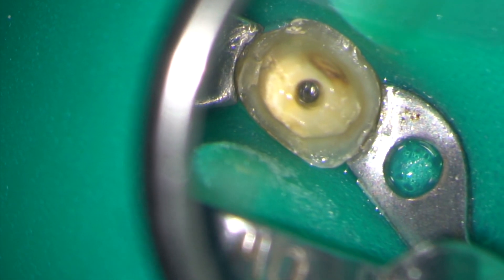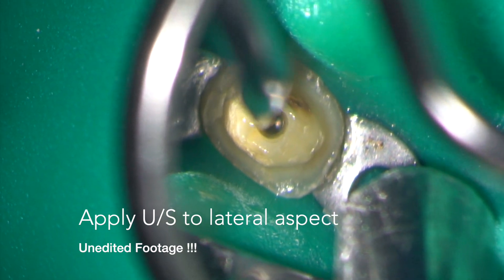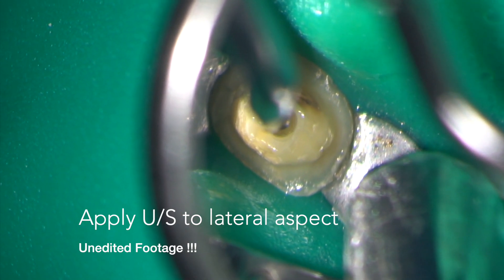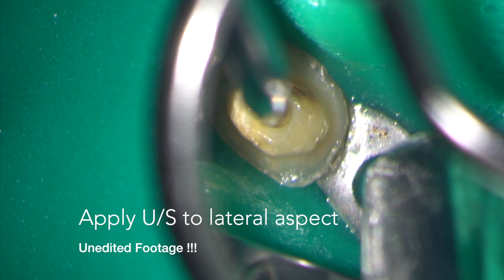The instrument is used dry, however it's sometimes helpful to have a little bit of liquid at the base of the access. The following footage is unedited and so you're seeing virtually what I saw on the day that I did the case.